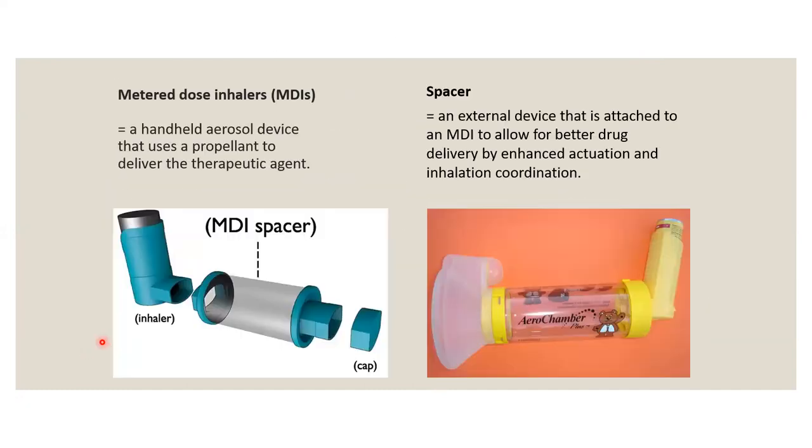More than 11 years old. 11 years? Okay, any guess? It's actually 8 years old. After 8 years old, you can change to the mouthpiece, because if the child has good breathing coordination, then the mouthpiece is actually better.